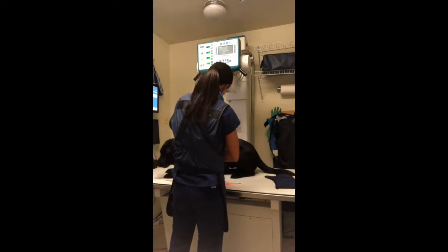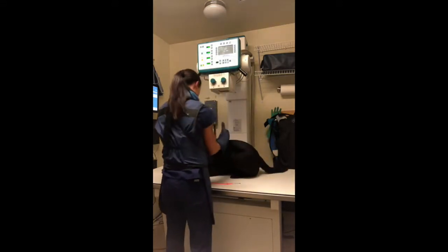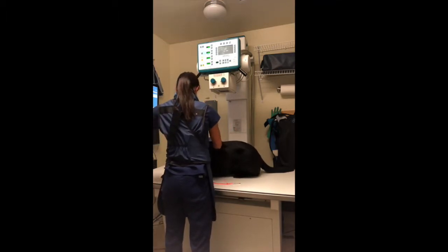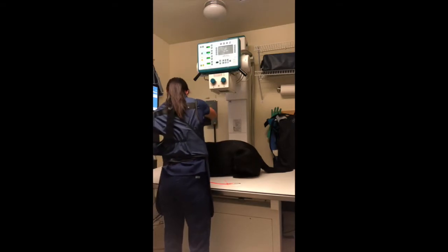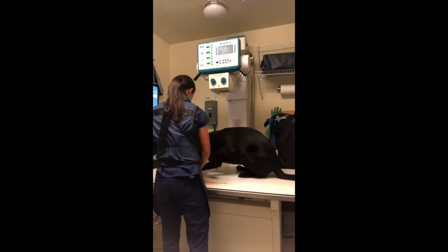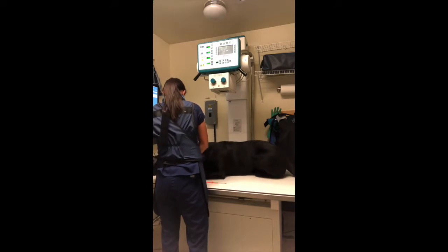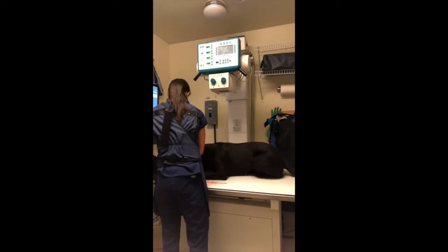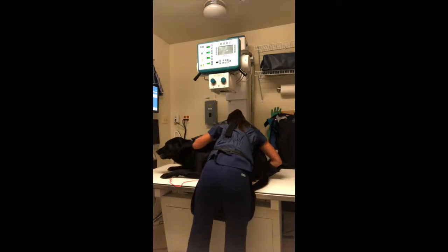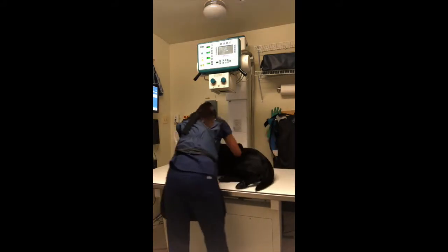Organic iodine non-ionic solution can be given by mouth or IV. It's used for myelography. It can be used IV, especially for young patients who are debilitated. Its pros include fewer side effects than the ionic form and rapid transit time. It's non-irritating. It's reabsorbed after extraluminal leakage. It does not become increasingly dilute. Ultrasound and endoscopy will not be impaired if the contrast study is completed first. Its only major con is that it's expensive.